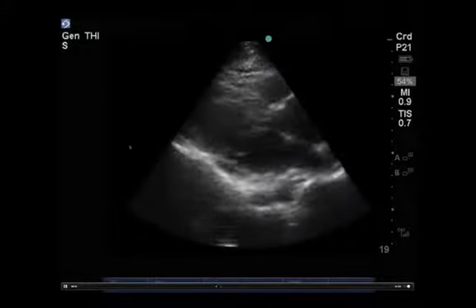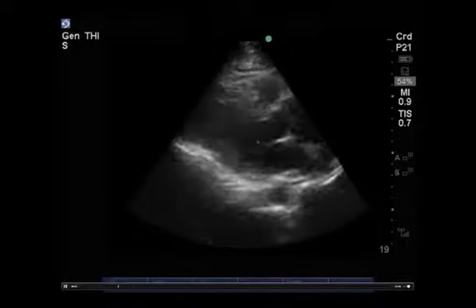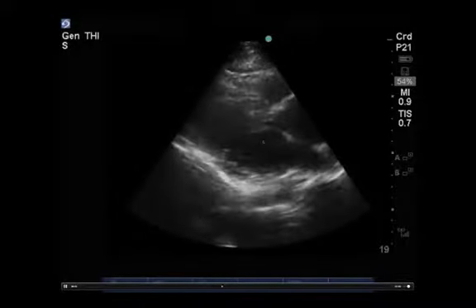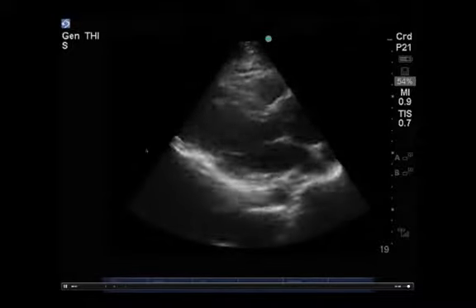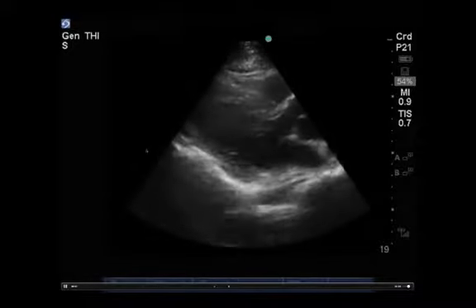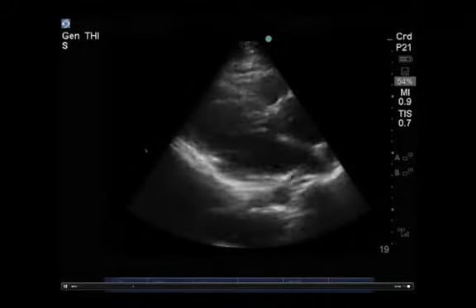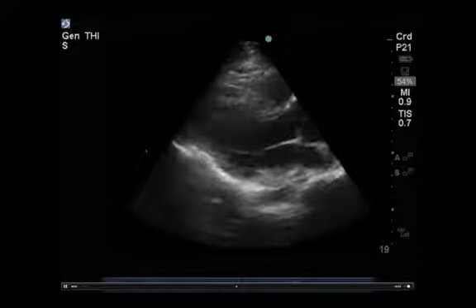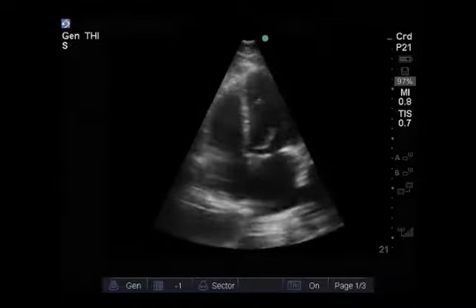And if you subtly look at it, I hope you may see that the anterior leaflet actually is reverberating or vibrating during these diastolic periods. And there's one right there, the easiest way to see it, at the end of this loop. You'll see it hovering in diastole, and you can see that vibratory movement. And we'll come back to this in a moment to explain what that is. But again, more clues about valvular dysfunction just through 2D assessment.